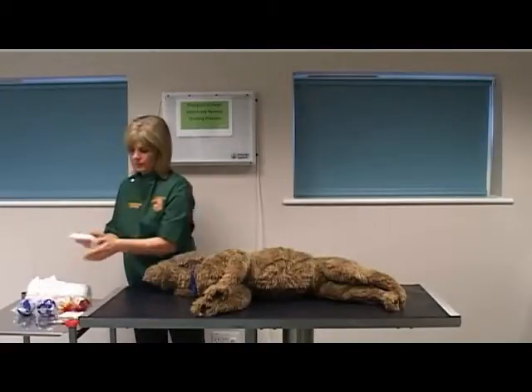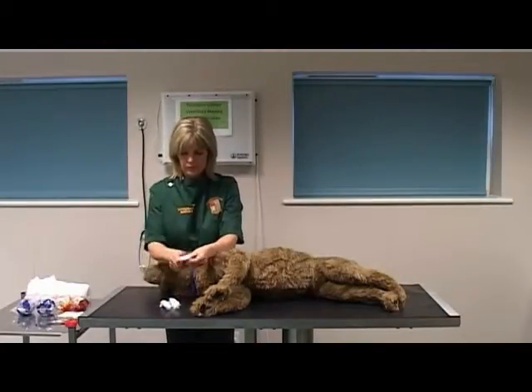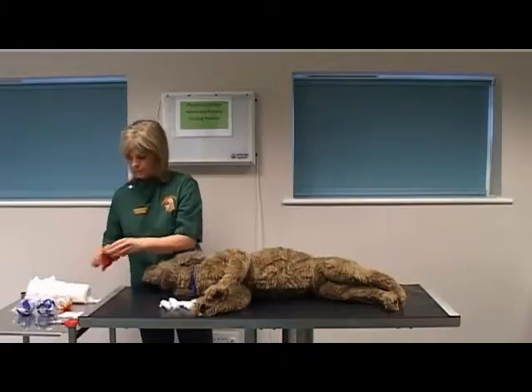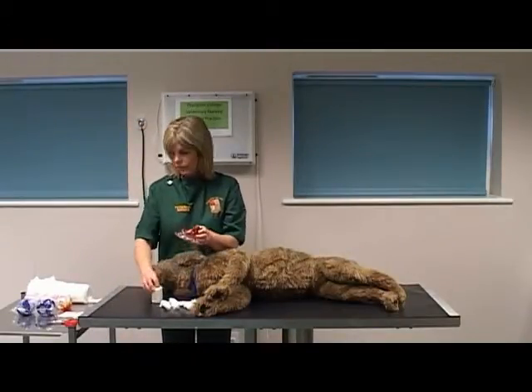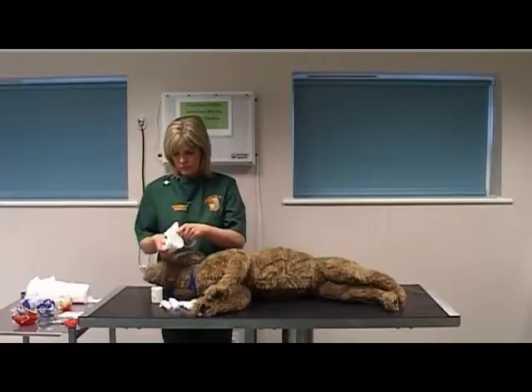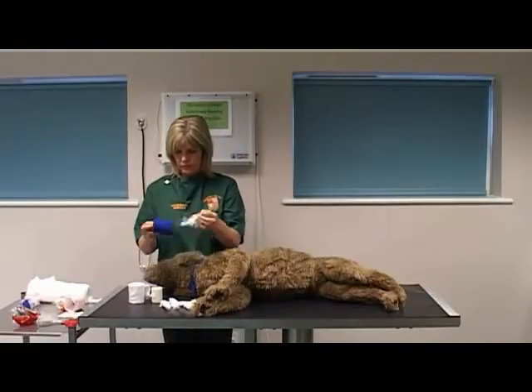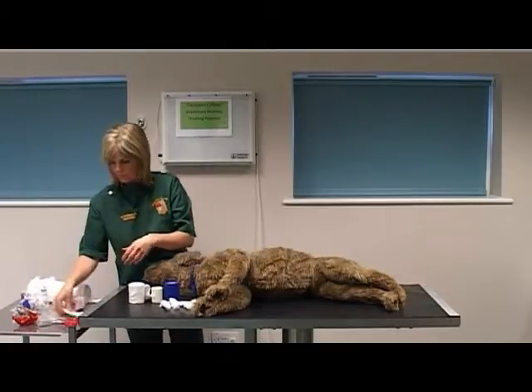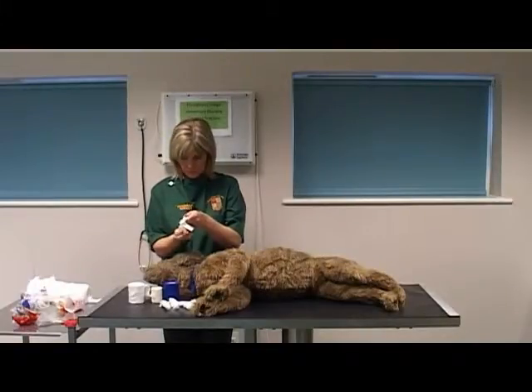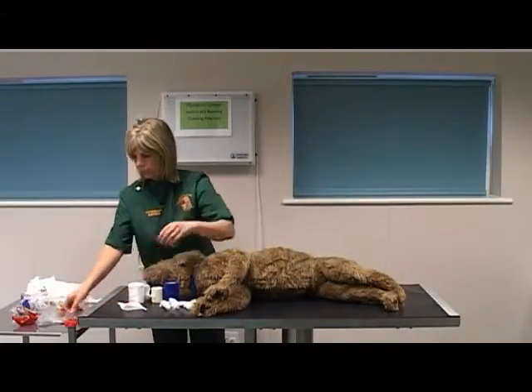Select and unwrap materials and equipment prior to starting the bandage. Select a small amount of padding for placing between the toes. Select a conforming bandage. Select a synthetic padding bandage. Select a protective layer. Select a wound dressing pad. Select a pair of scissors.